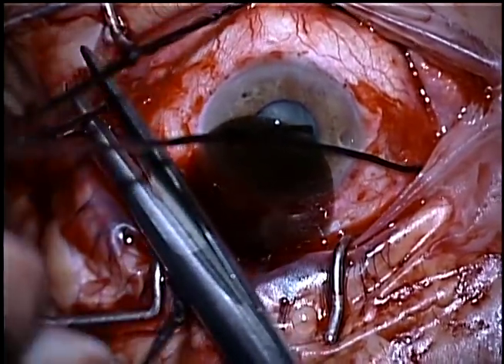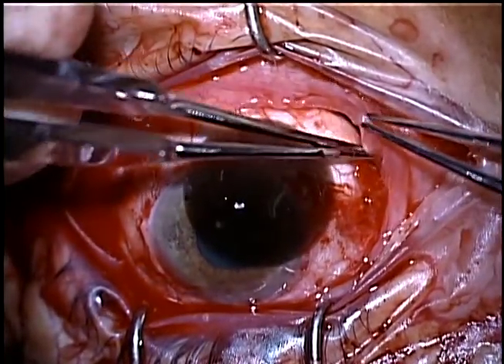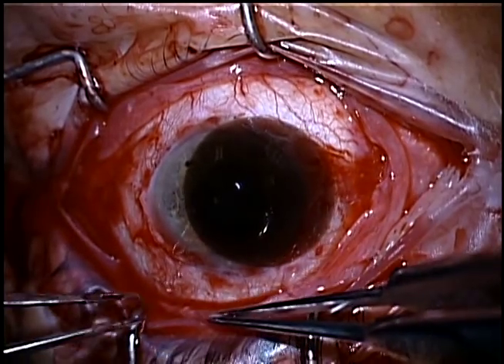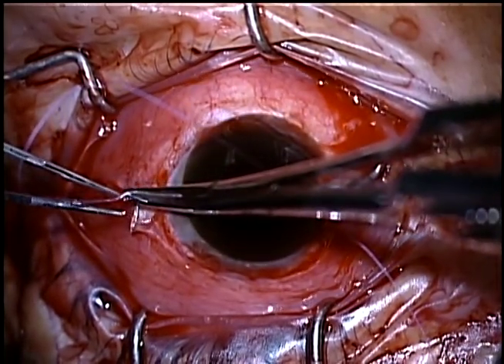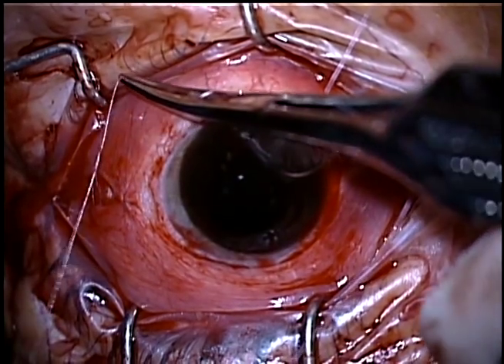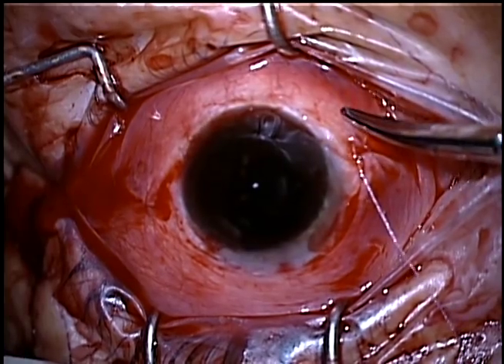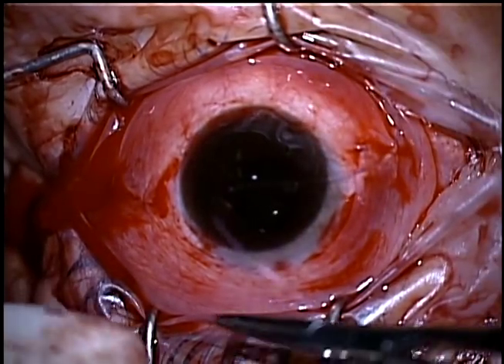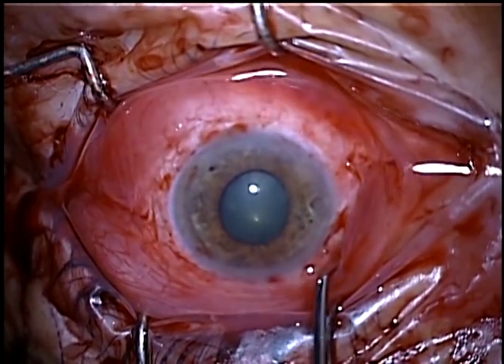Now we can remove the traction silk ties from around the muscles and then bring the conjunctiva and Tenon's forward for a careful closure to diminish the chances of the buckle exposing itself or becoming infected. I like to bury the surface sutures so that the knot is beneath the surface of the conjunctiva. It makes for a smoother healing for the patient with less sensation like there's something in the eye, less foreign body sensation. I'll often irrigate some Marcaine around the conjunctiva to diminish early postoperative discomfort.